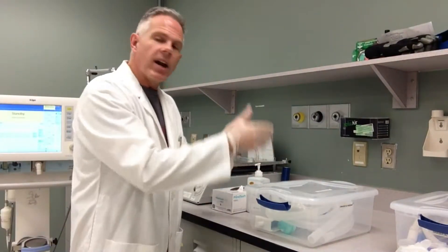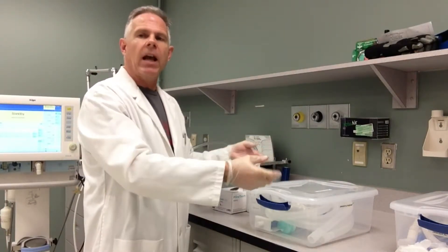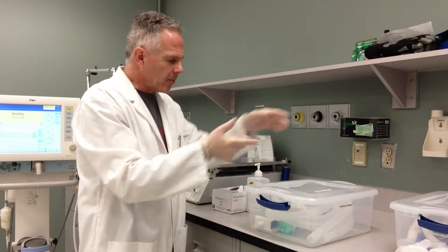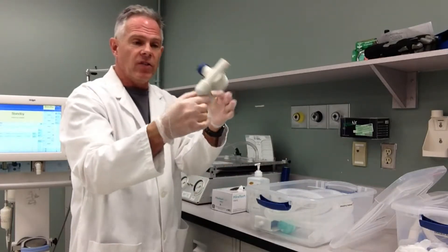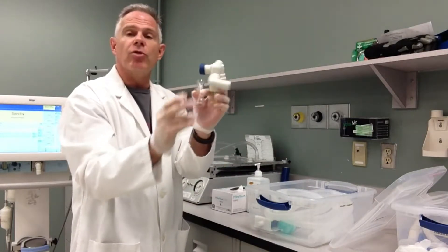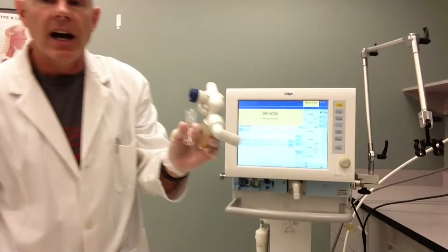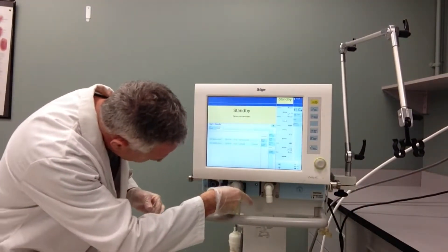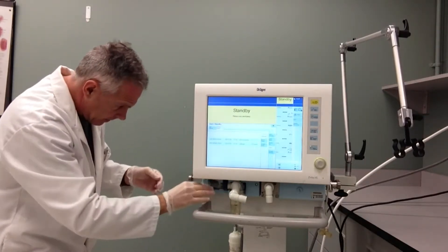We've got a nice sterile circuit inside a container here that's been sterilized and cleaned. In a real patient situation, it would probably be in a nice clean bag just coming up. For this particular ventilator, I need a couple of components that have to be attached individually to each patient — that's the exhalation valve and the flow sensor. Let's come over and quickly put these on our patient circuit while keeping our hands clean. Just quickly insert and we can put our flow sensor in place.